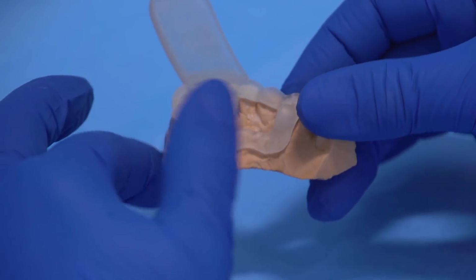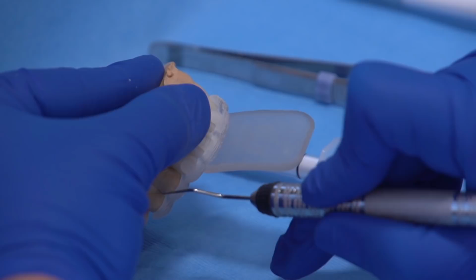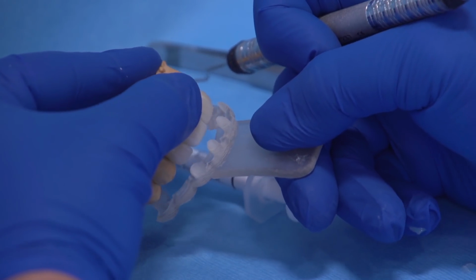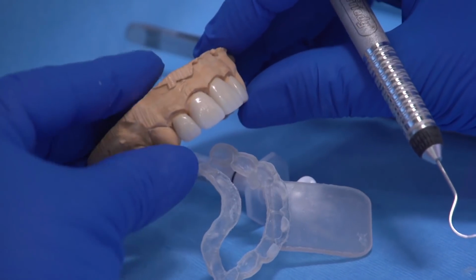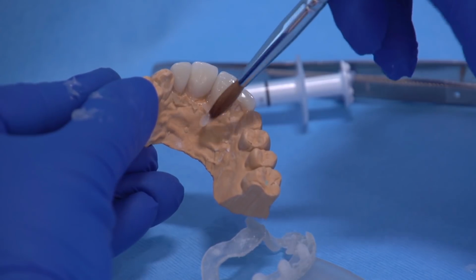This tray uses a palatal and an occlusal stop to ensure optimum placement. It is translucent, so it allows the choice to cure the luting material if the seating is correct, or provide easy removal to facilitate cleanup and verification of the correct insertion.